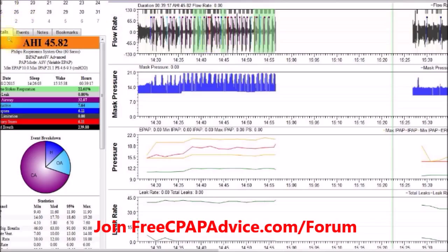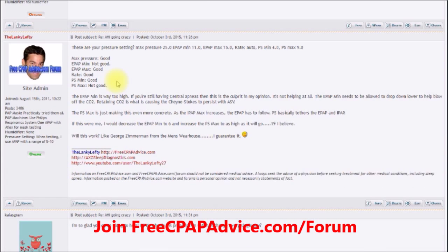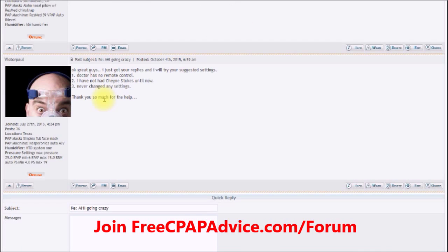You can see most events are clear airway — their way of saying central apnea — and you can really see the waxing and waning pattern throughout the entire night. The green shaded area denotes Cheyne-Stokes respiration or periodic breathing. Looking at his settings: EPAP min was 10, IPAP max was 21, and pressure support was 4.5 to 9.5 — they had really reined this machine in, like putting a governor on a sports car.